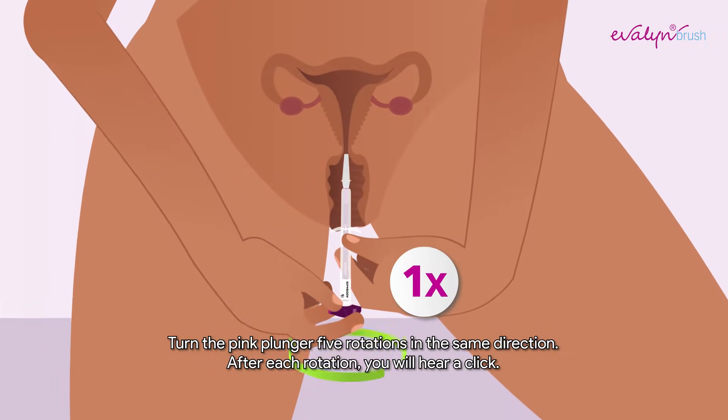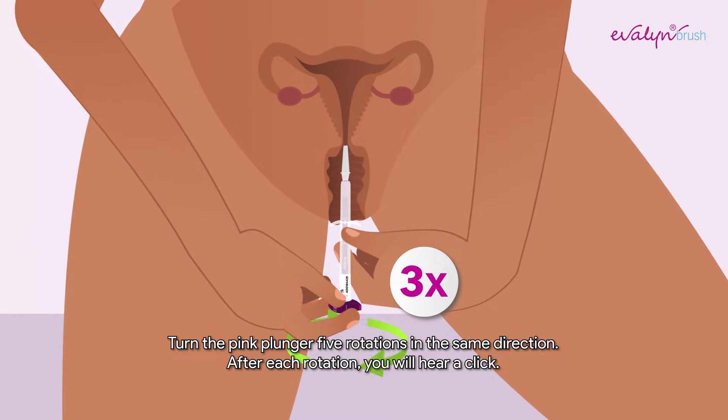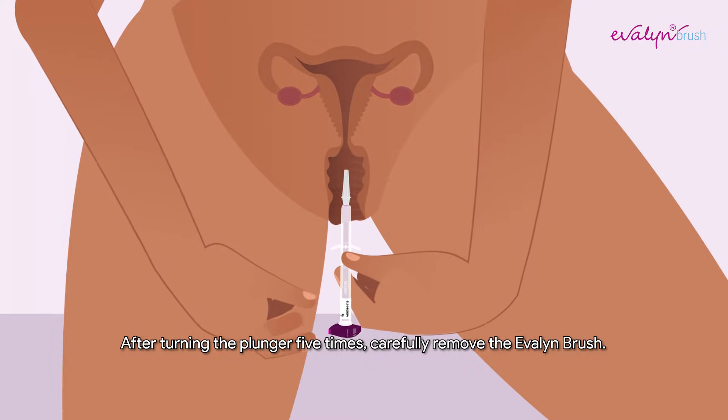Turn the pink plunger five rotations in the same direction. After each rotation, you will hear a click. After turning the plunger five times, carefully remove the Evelyn Brush.